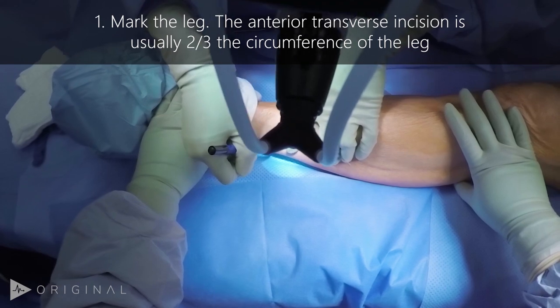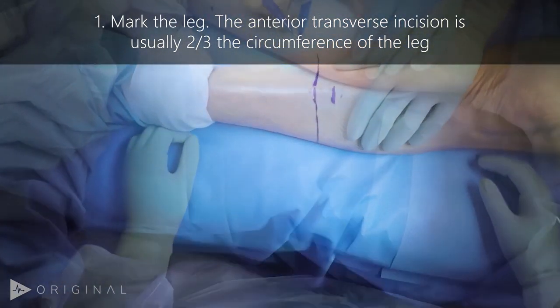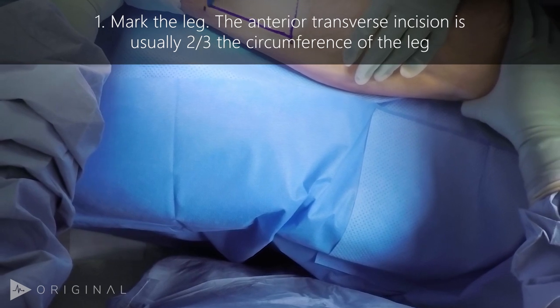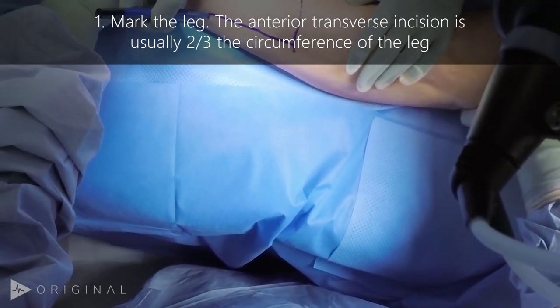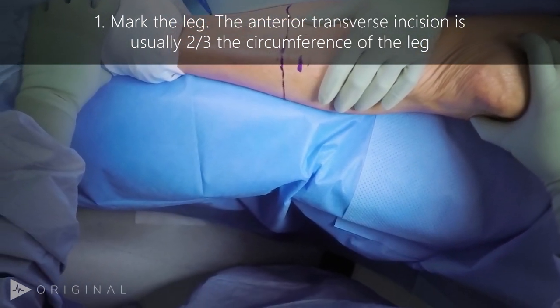The first step of the procedure is to mark the planned incision. This is done by measuring the leg's circumference, then using two-thirds of that length for the anterior incision, and one-third of the length for the distance to the posterior flap.